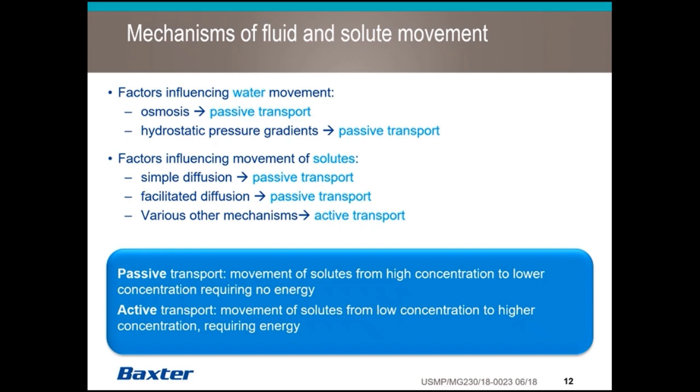Sodium is one of the lightest weighted electrolytes in our body. It weighs 23 Daltons. So sodium is very easily going to diffuse back and forth across capillary walls or these membranes. This may explain why it is sometimes so common for a patient to get hypernatremic or hyponatremic when you're having major fluid shifts because of the low molecular weight and the ease of diffusion with sodium.